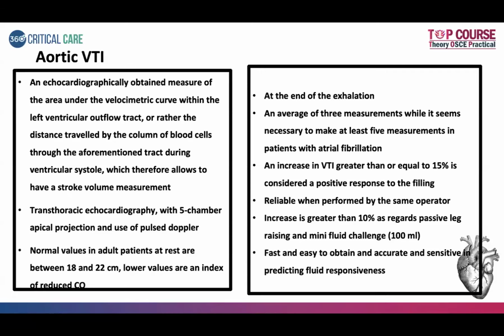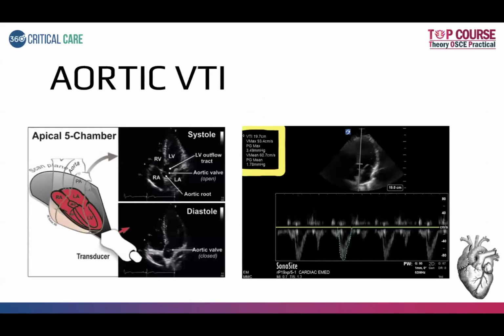So usually you take an average of 3 measurements, while at least 5 is the best in case of atrial fibrillation. An increase in the VTI greater than or equal to 15% is considered a positive response to the filling. So if it is done by a single performer, all the better. If suppose you are using passive leg raising or a mini fluid challenge, even a 10% increase is considered to be fluid responsive. It can be done at the bedside, and it is a rapid and easy, less time consuming method.